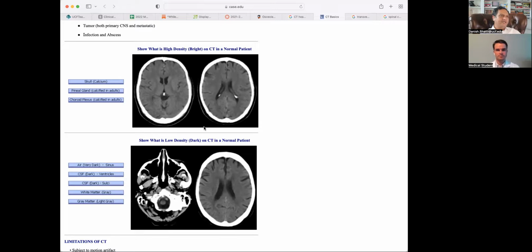So let's look at a CT scan image and see what exactly is the information that we are getting. If you look at it, there is the darkest point on CT scan, which is black, and there is a brightest point on the CT scan, which is white. And CT scan is a range of whiteness between absolute black and absolute white. And the range is divided into minimal units, which are called Hounsfield units, HU.